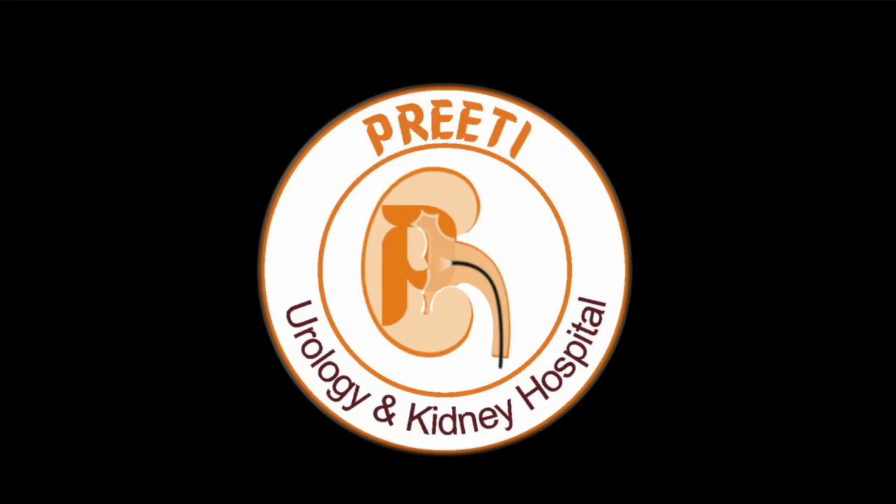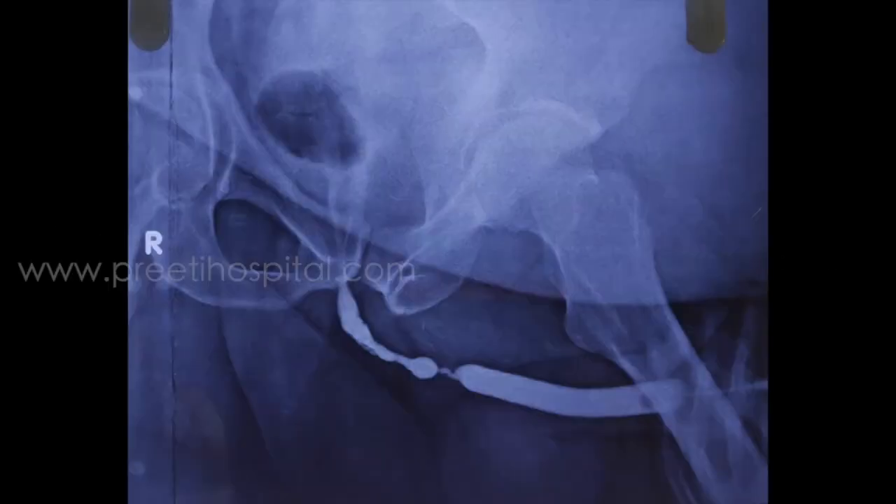I am sharing a case of stricture urethra during the COVID time. The patient does not want buccal mucosa urethroplasty, so temporarily optical internal urethrotomy (OIU) is done. This video discusses the role of the guide wire in a patient who has previously undergone surgery.